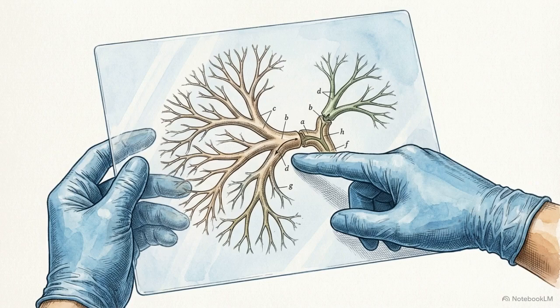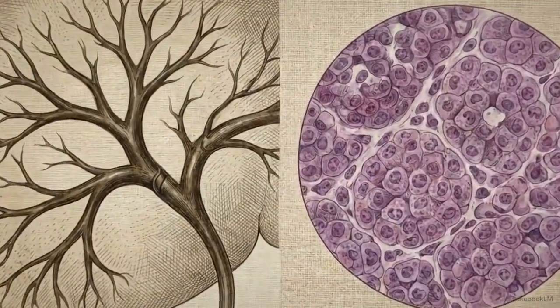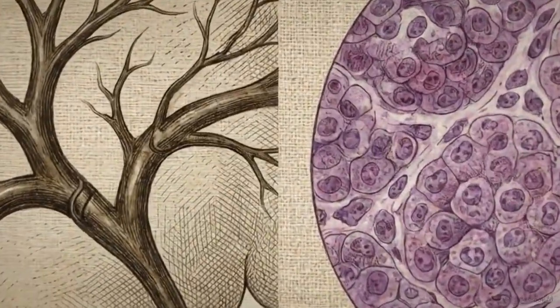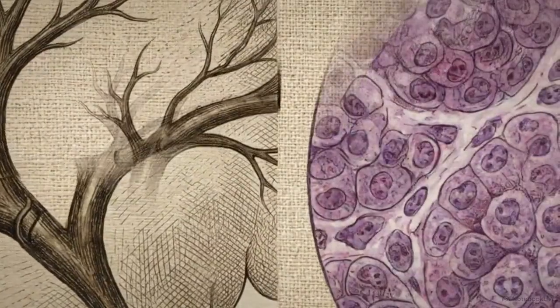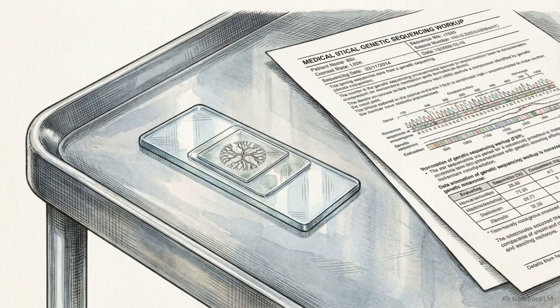If atresia is confirmed, the cholangiogram provides a map of the ductal anatomy for the surgeon. A needle biopsy is also performed to examine tissue for bile duct proliferation and portal fibrosis. This combination of macroscopic mapping and microscopic biopsy provides the verification required to perform major surgery on a neonate. The biopsy also serves to rule out genetic conditions that can resemble atresia.